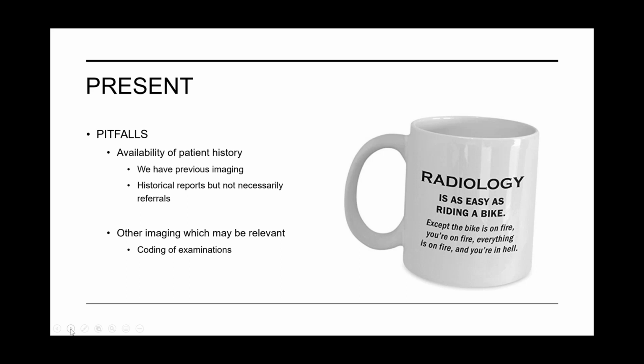We also looked at how examinations are coded, and there is a bit of variability between sites, and that in itself, when it comes to displaying with PACS, can lead to issues with how PACS displays certain images or pulls them. And you need to have an intelligent way of mapping that.